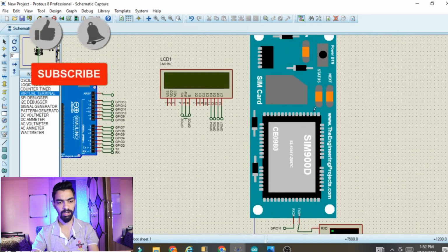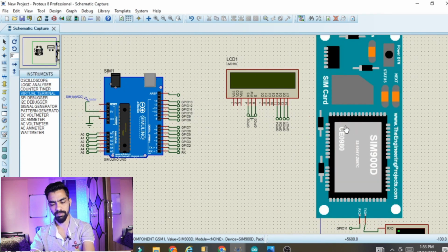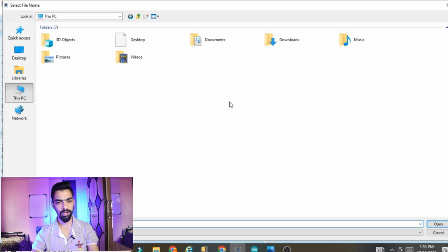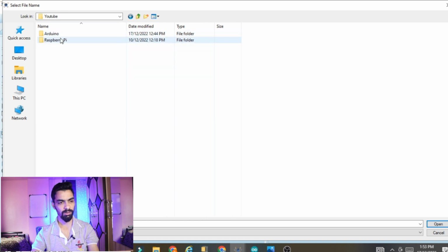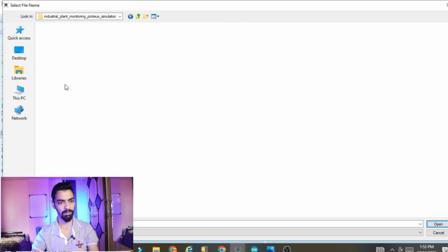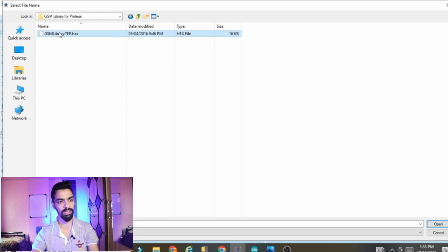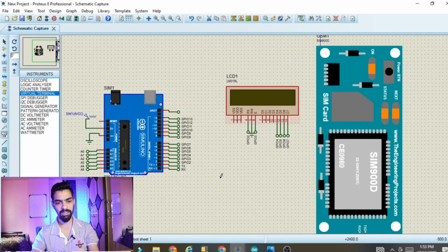Then after that you can double click on this GSM model. Here you have to load the hex file of the GSM model. So go to the folder, then go to my downloaded folder from my Google Drive link. There you will find one GSM folder. So go to that folder, Arduino, then industrial plant, and here is the Proteus simulation GSM library. Go inside this folder, you will find the hex file. Click on this hex file, click on open and click on OK. So in this way we complete the GSM part.